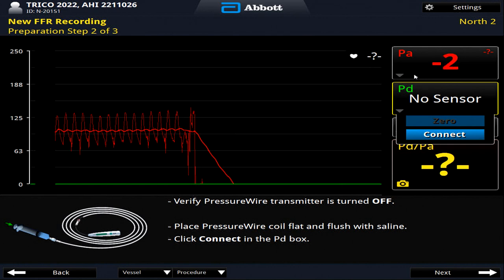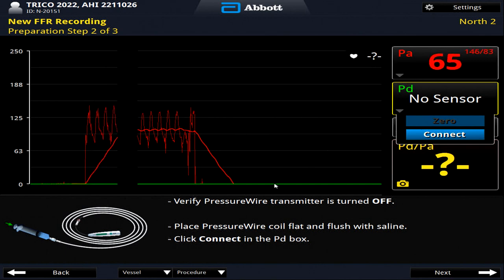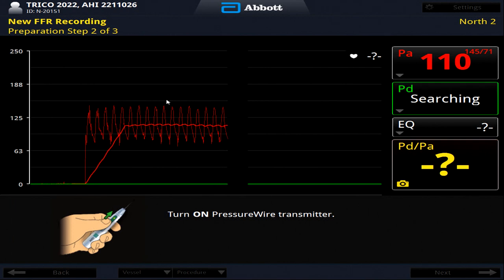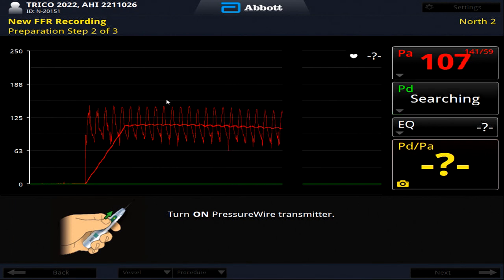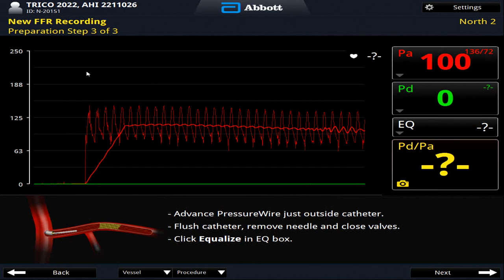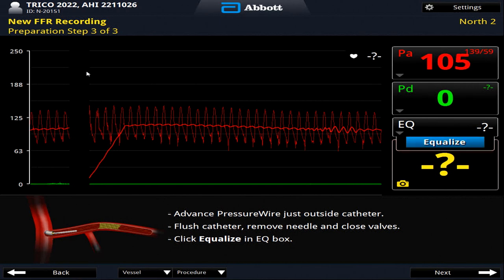We decide not only on lumen, because we have to pay attention to the morphology. In this case, the proximal side has a little bit small size of the lumen, but the plaque is very eccentric, and we can identify that very thick calcium behind the region. So I'm afraid too much dilatation in the proximal side may cause a problem.